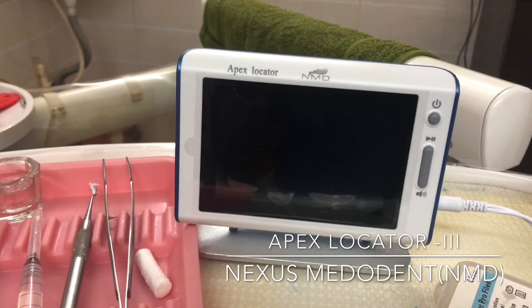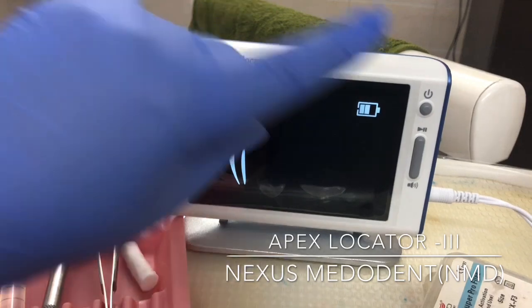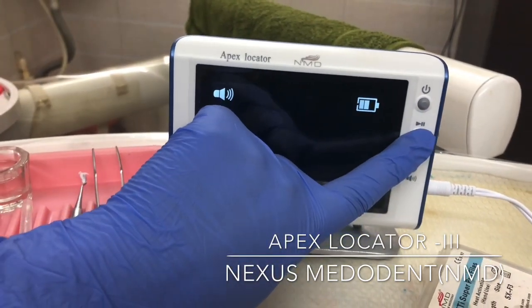So let me just switch this on first. They have a charger here, there's a volume control, and this is the play mode.